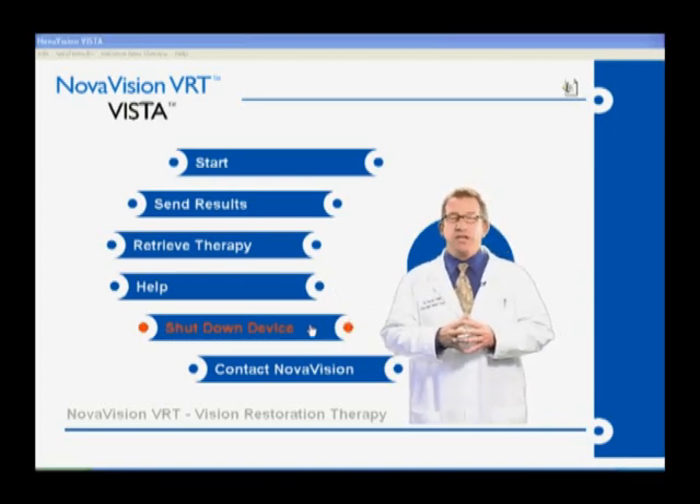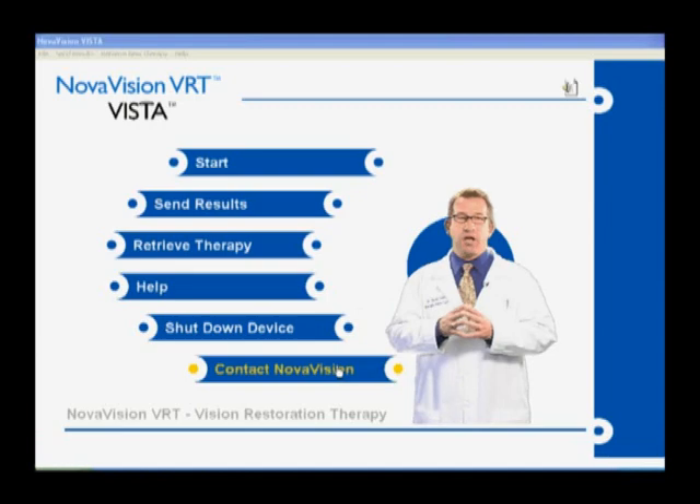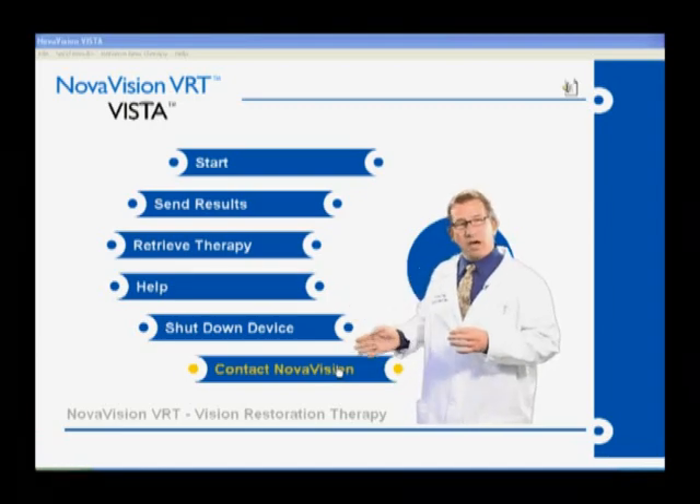If you need help, have any questions, or want to see any of the instructional videos again to clarify things, you can do that by clicking on the help bar. Lastly, if you need to contact NovaVision — and we're glad to hear from you — if you have any questions or problems, please don't hesitate to call. Simply click on the contact NovaVision bar and we're there for you.